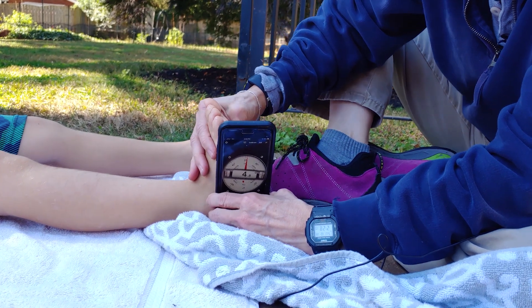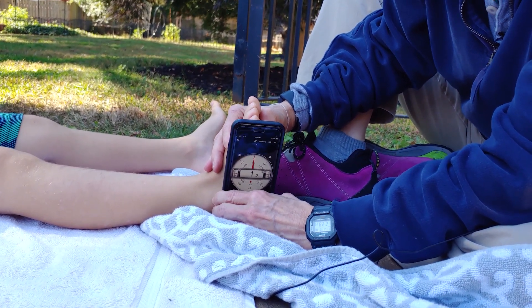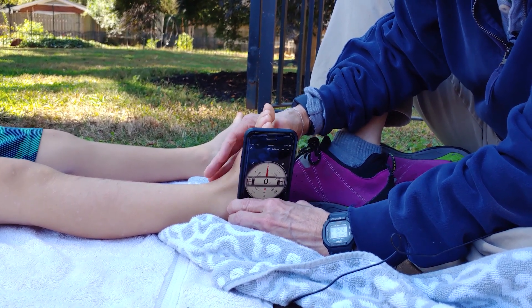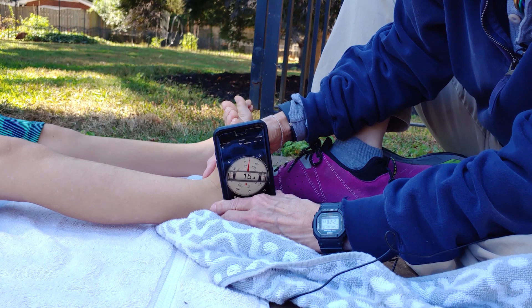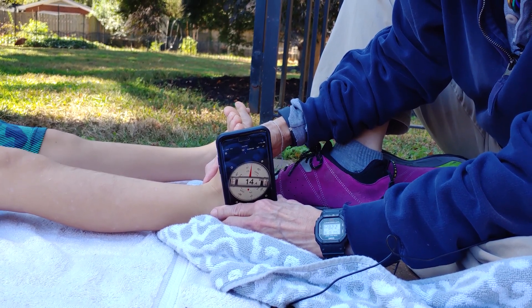All right, let me get centered again and get started. Straight up and down. Pull up your foot for me — go up as far as you can. So it looks like active, he's got about 15 degrees, as opposed to when I pushed on him and he had 20.